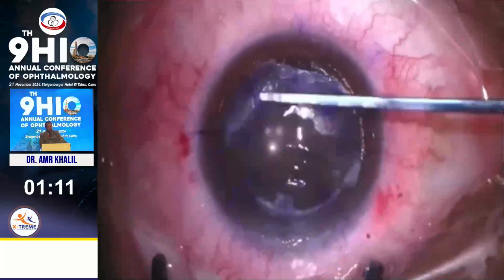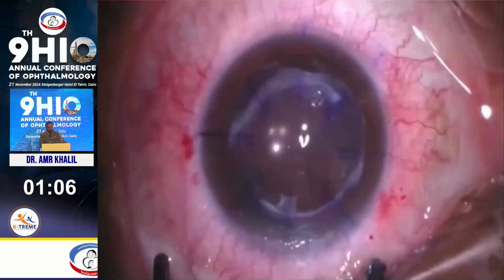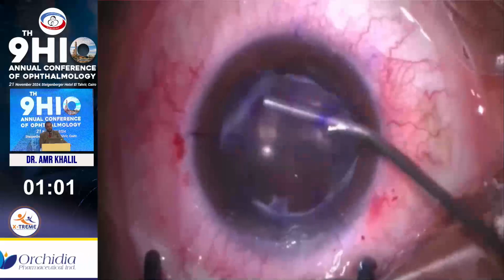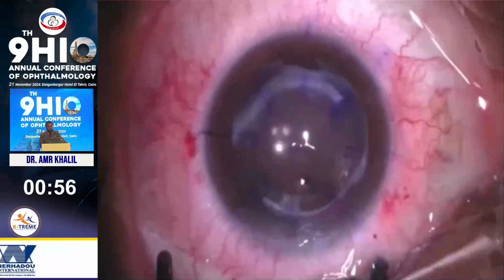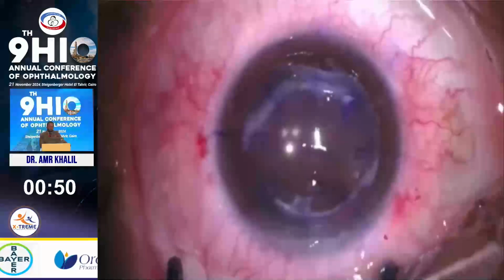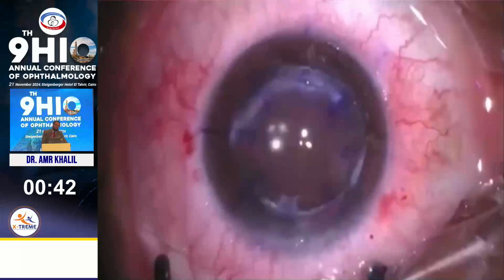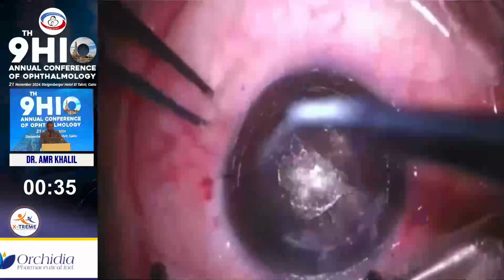Now I was able to bring the flap back to its original position, using distilled water at the interface to remove any debris or cells, and also to treat this macrostria by massaging, ironing, or milking of the cornea. Usually in mild cases we use a contact lens, but in severe cases such as this case, I decided to place 7 multiple interrupted 10-0 nylon sutures.